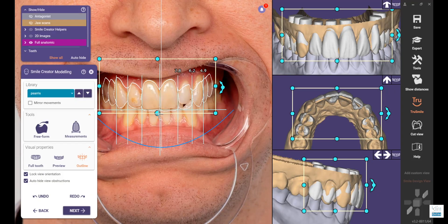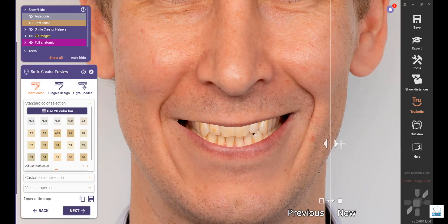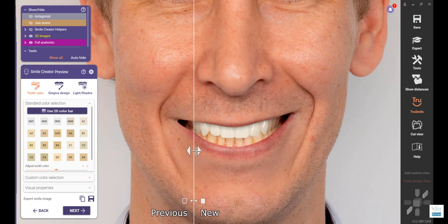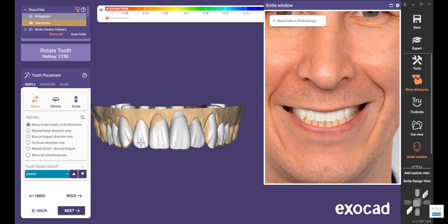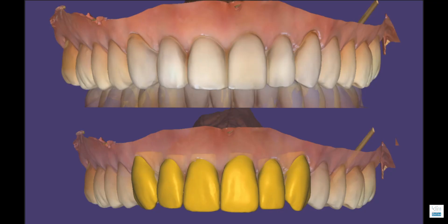I use two approaches. One uses a full face feature with the smile design feature in the ExoCAD software — that's really nice for a new patient who's considering a smile shift. The other approach is a digital wax up without the full face, when I'm making minor changes to restorations that don't impact the face much because I already know the lip line and the length I want. So there are two ways to do that.